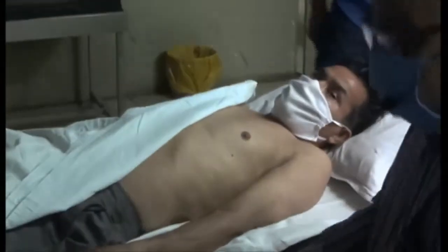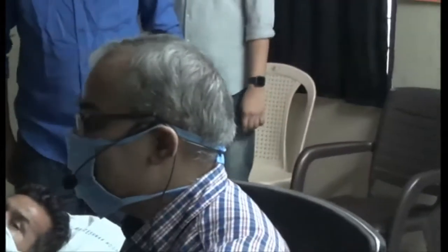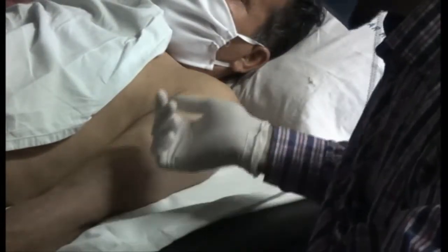While doing the upper limb Doppler, as I am assessing his left side, I am moving down the other way, because this makes it easy to traverse the course of the arteries in a simpler way, and seeing from the other side it becomes difficult. I have to stretch my body, stretch my shoulder, everything, and then we can do maneuvers if necessary very easily in this position.